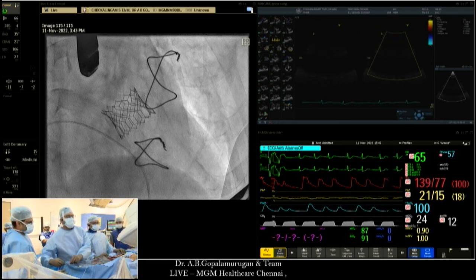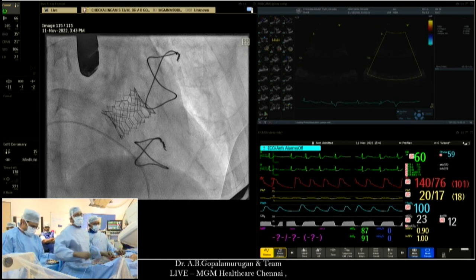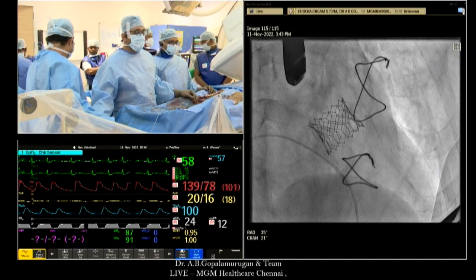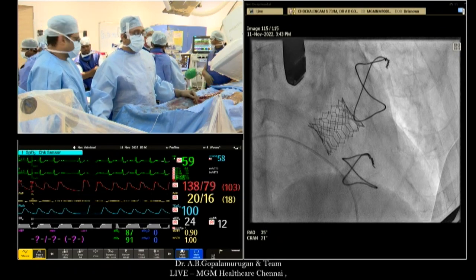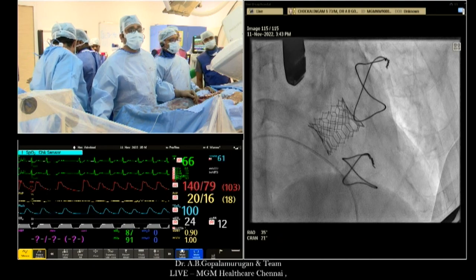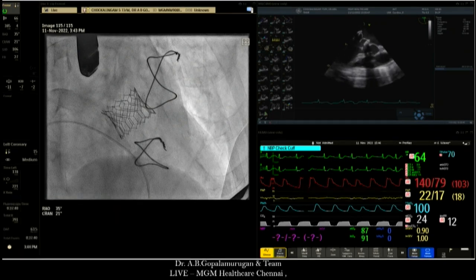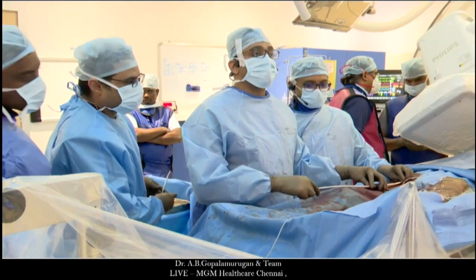One question. Will there be any strategy difference if it is a stenotic degeneration versus a regurgitant degeneration? It's all the same, it'll be exactly the same, stenotic or regurgitation. But with stenotic, you probably want to be very cautious about embolization. It's better to put a sentinel with stenotic valves because the chance of embolization is much higher. And when it comes to valve sizing, it is more forgiving to undersize rather than oversize a stenotic valve, because you have so much tissue and pannus that the valve sometimes doesn't even dilate well enough. That's the only difference. But otherwise, the strategy, transseptal, everything is the same.